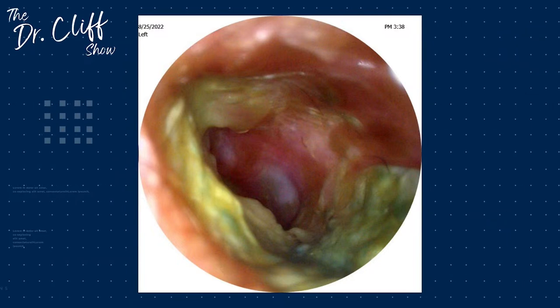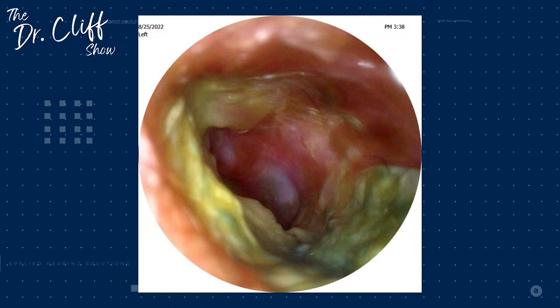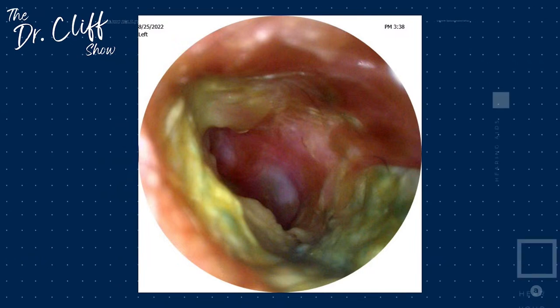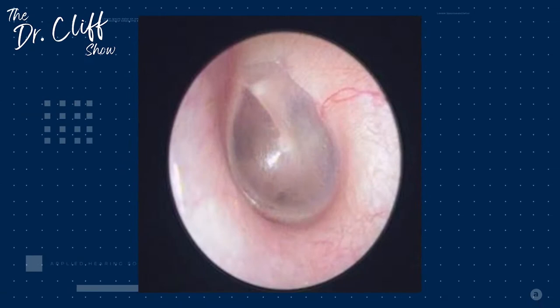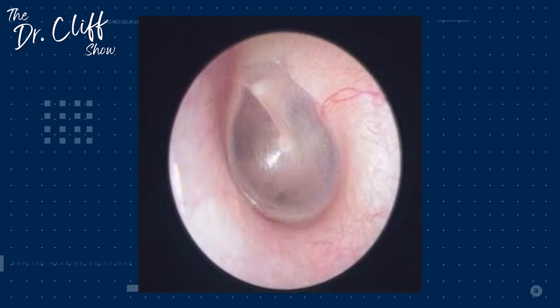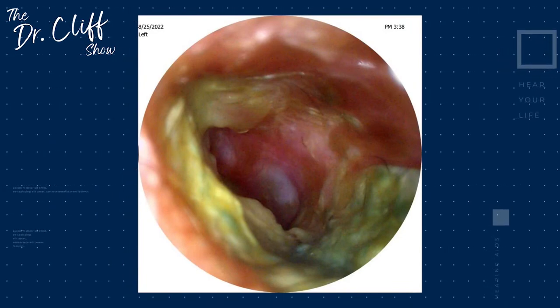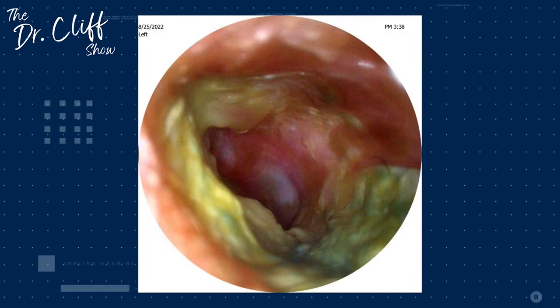And if you will refer back to the previous normal otoscopy, this does not look very normal. So anytime we look in the ear canal, we can see some pink tissue, maybe a little bit of red tissue. Yeah, just like that. Beautiful, right? We should not be seeing green. We should not be seeing blue. We should not be seeing bright yellow. That is all very, very telltale signs of an active outer ear infection. And that's something that we have to refer out. We need to get that individual to see a medical doctor to get treatment for that.